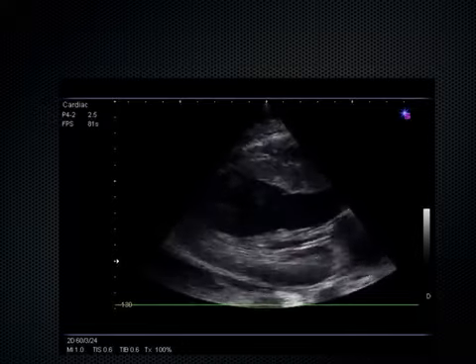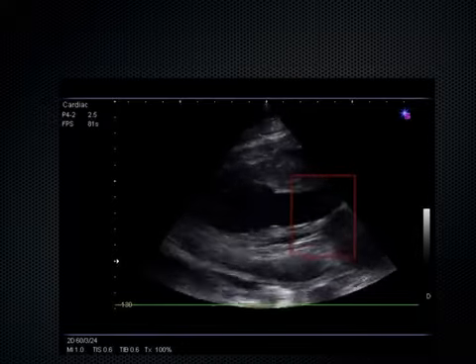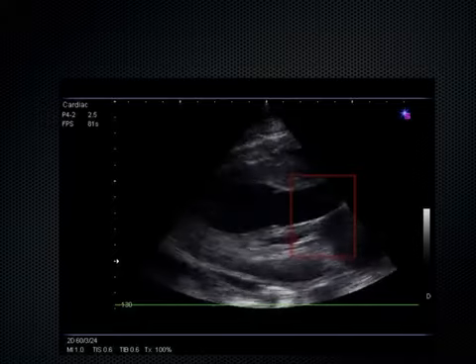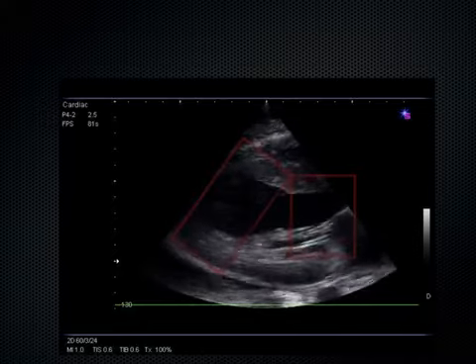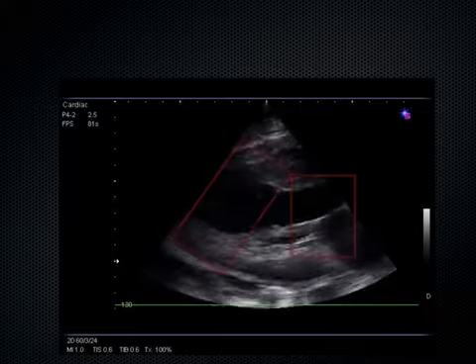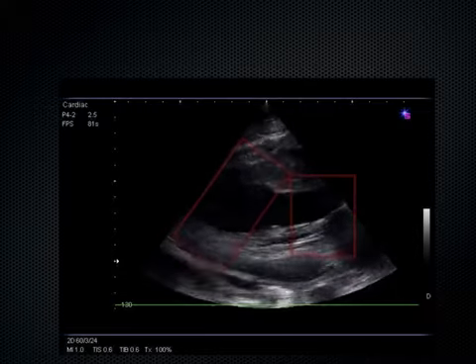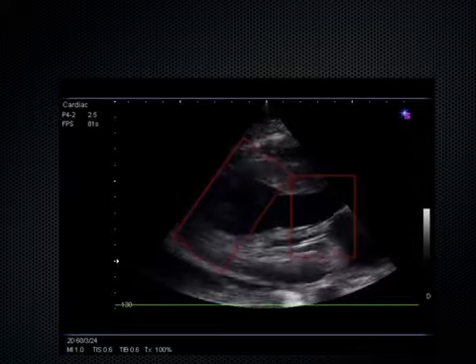How do I know that? Well, I'm going to first look over there at that mitral valve. Is it smacking the septum? Nope. And then I'm going to come over here to that posterior wall and the interventricular septum. Are those two things coming together? Nope. So this person, if I gave them fluids, it could back up in their lungs, and I have to be very careful here.